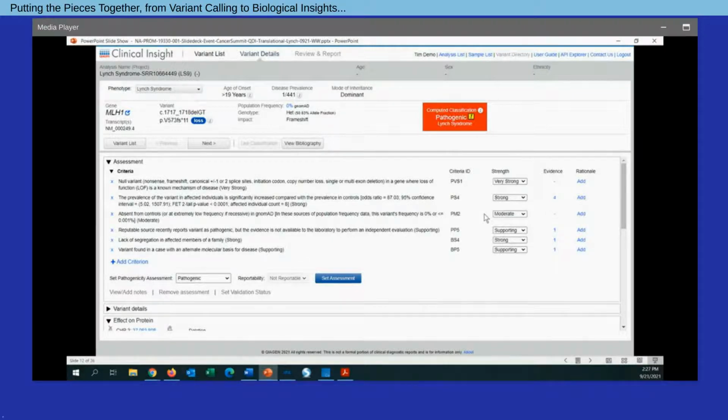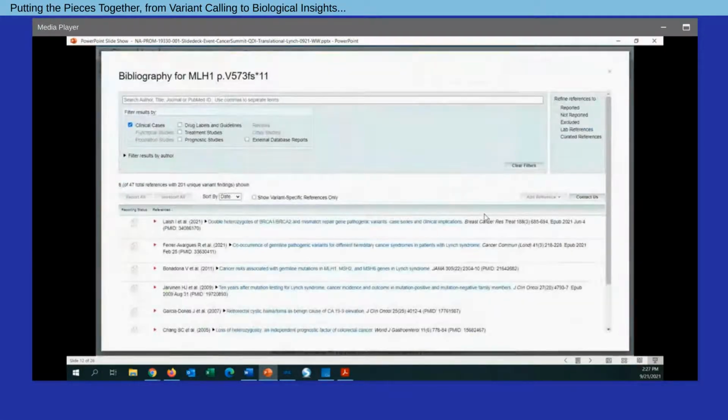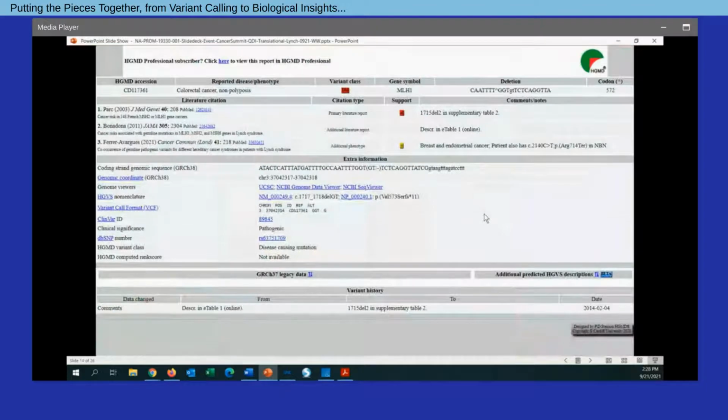Now, along with this classification, we will also generate the bibliographic information as well. So all of the curated literature that we have for this particular variant of interest. And I'll actually go through this in a little more detail within the software. But the final thing that I just want to showcase to everybody is that, in this context, when we're talking about germline variants, we have the ability to link out to HGMD, and through the table we saw earlier, we'll be able to get at the full set of information found within HGMD as well.